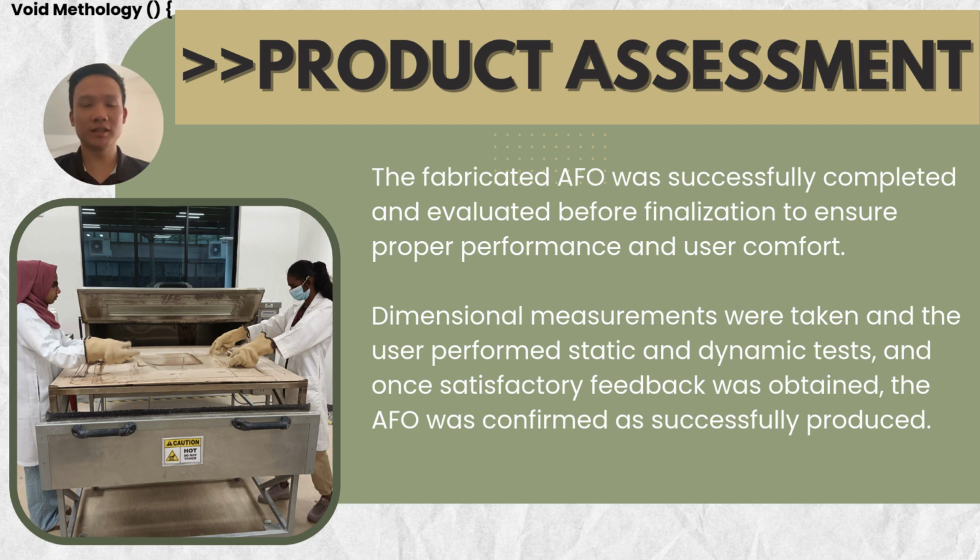The user then performed several tests using the new AFO prototype, including standing still, walking at a normal speed, and giving some feedback on the comfort. This step is very crucial to ensure that the AFO doesn't cause discomfort and fitting problems when they use it for a long time in the future.